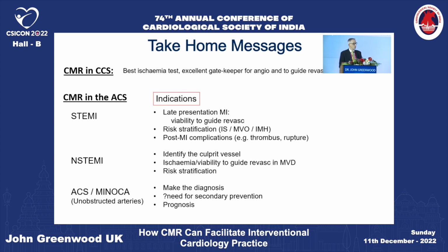And I would say that almost every day in our unit we're doing a CMR for somebody who's come with an NSTEMI and turned out to have MINOCA, to try and work out, is it a cardiomyopathy, is it a missed infarct, or whatever the diagnosis is. So lots and lots of ways in which CMR is really useful.